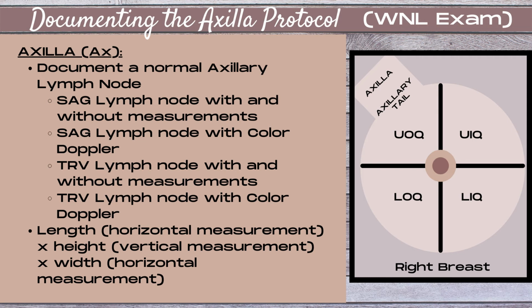You can do 2 measurements in a transverse plane and 1 measurement in sagittal, or you can do 2 measurements in sagittal and 1 measurement in transverse. The most important thing is that you are doing a length, a width, and a height.